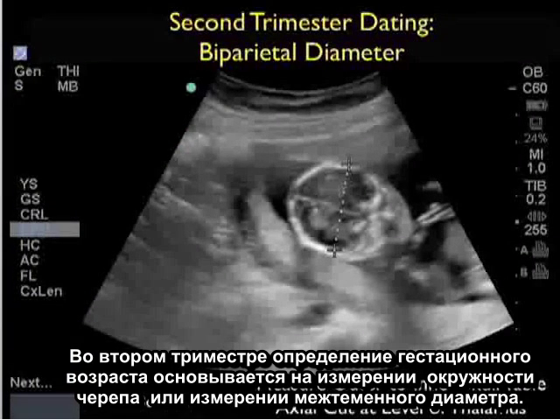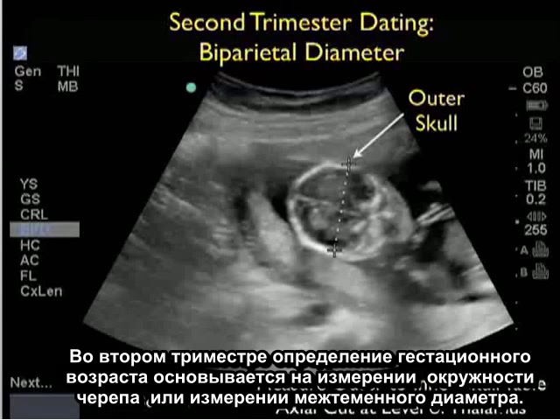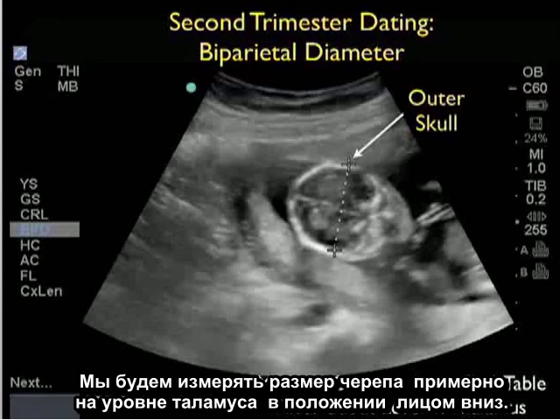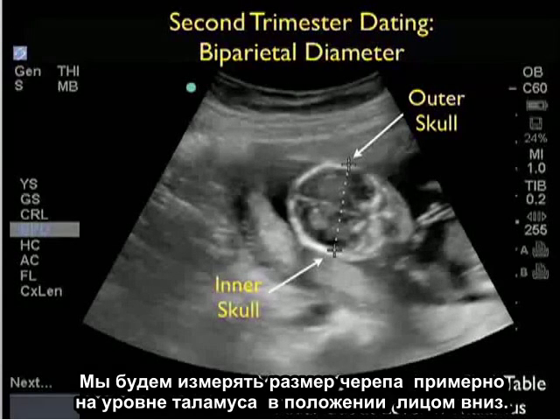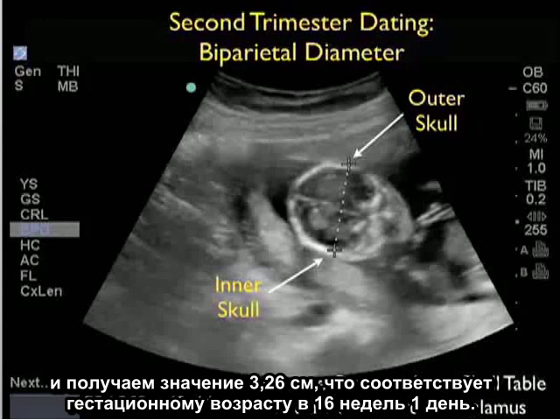In the second trimester, dating of gestational age focuses on skull circumference or measurement of the biparietal diameter. We want to measure the skull at about the level of the thalamus in an axial orientation with the face down. We're placing the calipers from the outer skull table proximally to the inner skull table distally, and we have a measurement of 3.26 centimeters correlating to a 16 week, 1 day gestational age.